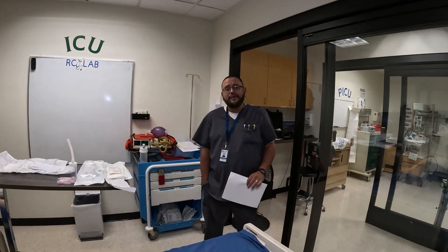Hi and welcome. I'm Harvey Olivia Carrington, clinical instructor at Carrington College. We are going to do our competency for endotracheal suctioning.